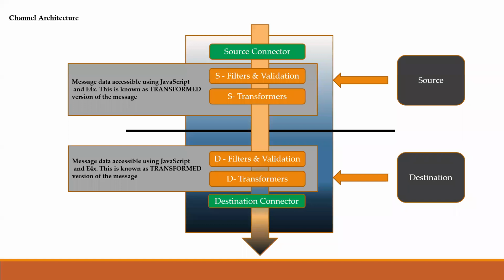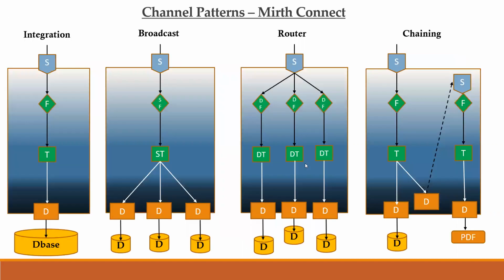Okay, but any channel will have these two components. This is the base architecture. Okay, any questions before we proceed on to the next slide? All right, I'm not hearing anything, so let's go ahead and proceed to the next slide.